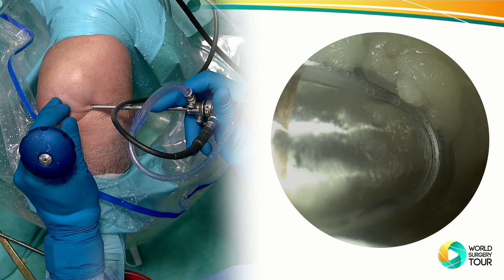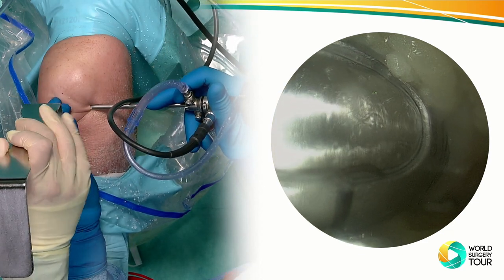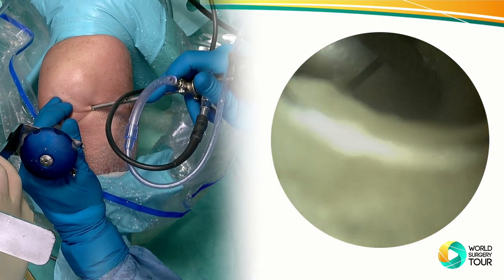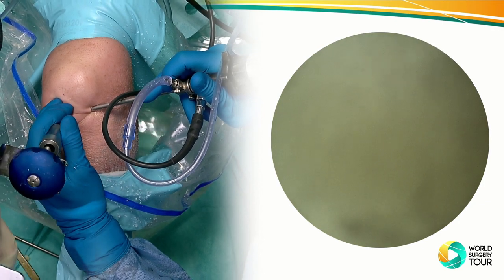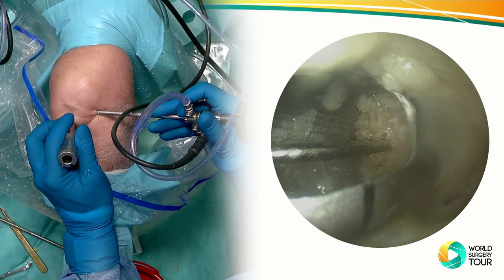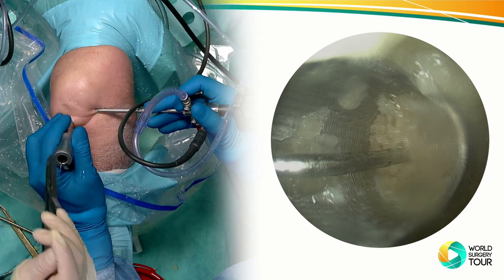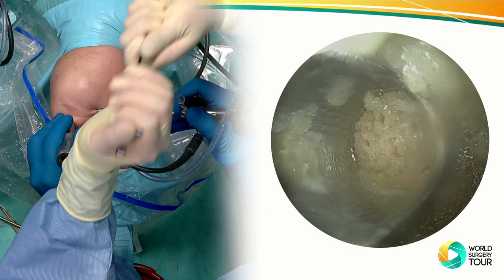Okay, it looks nice. Then we use an extractor here. Stephen, please hammer on the extractor. I stabilize while he's doing it. The cannula, I'll come into the side. Okay, here we go. And now you can see the holes. Now we remove the center wire. And the extractor again, please. Okay, here we go.